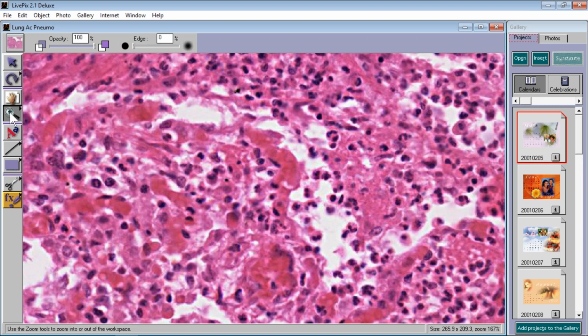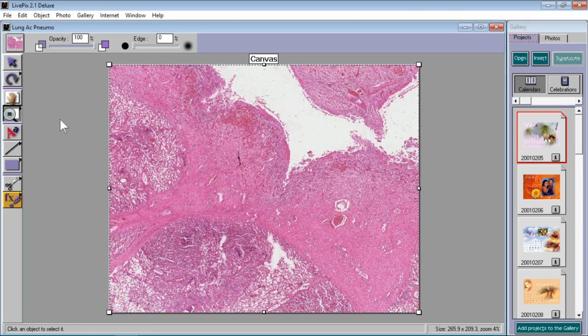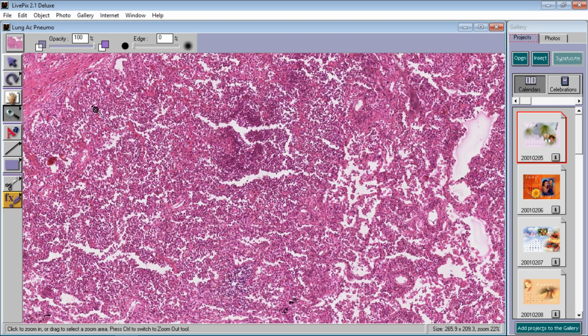And hold on, maybe we could even find a bigger area. If I recall when I was looking at these last night, oh yeah, take a look at this area down here. We're going to blow up this little area in the southwest. And look, there's hardly any alveoli at all. It's all neutrophilic infiltrates.